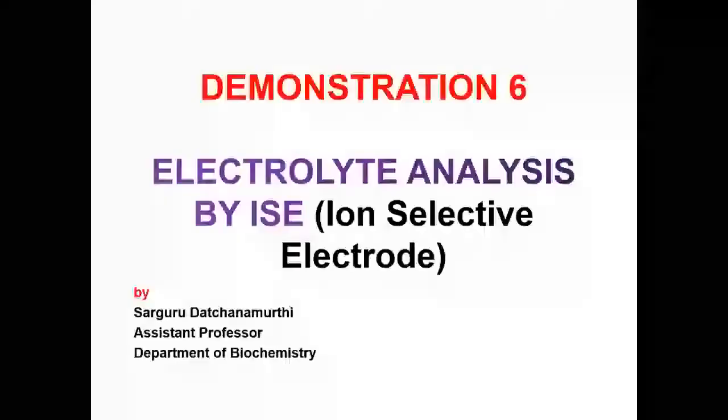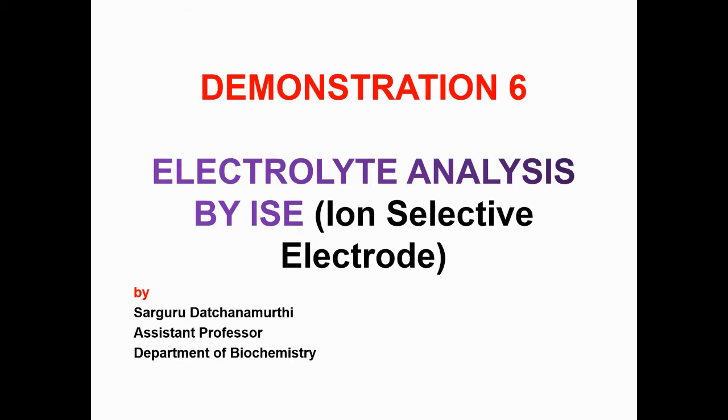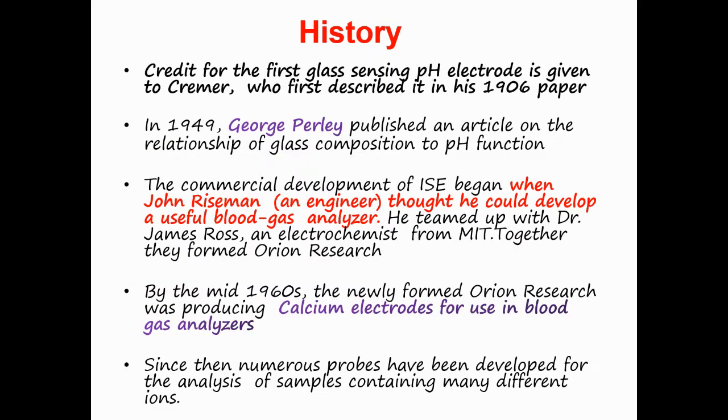Make a note of it: ISE is ion selective electrode. By this method only, we are estimating the electrolyte levels in the given sample.